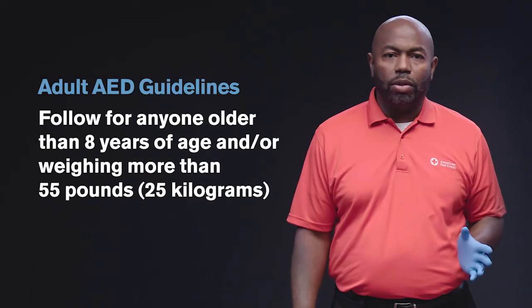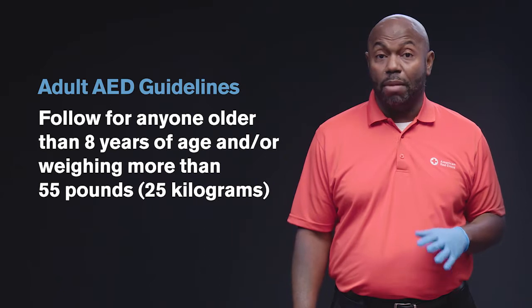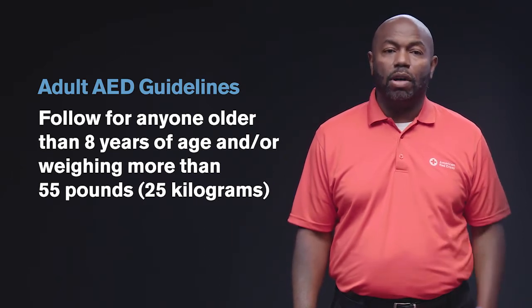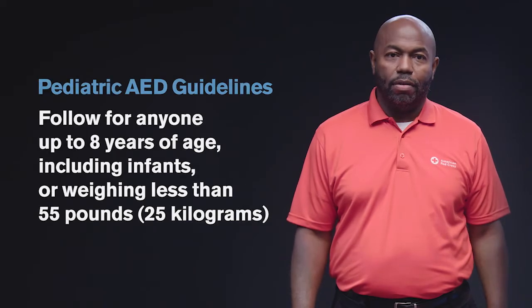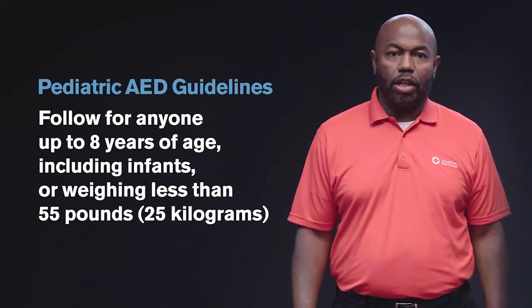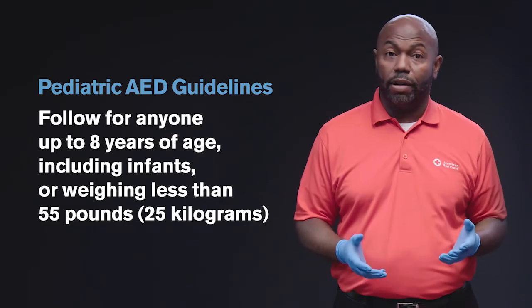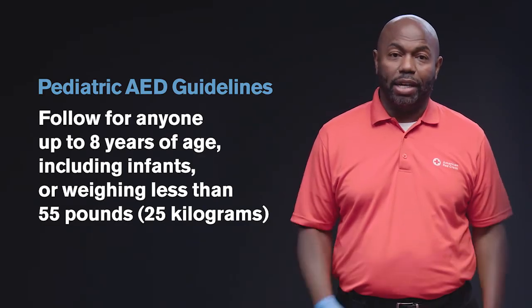When using an AED for children and infants, follow the appropriate guidelines for their age and/or size. For anyone older than 8 years of age and/or weighing more than 55 pounds or 25 kilograms, follow adult AED guidelines. For anyone up to 8 years of age, including infants, or weighing less than 55 pounds or 25 kilograms, follow pediatric AED guidelines.